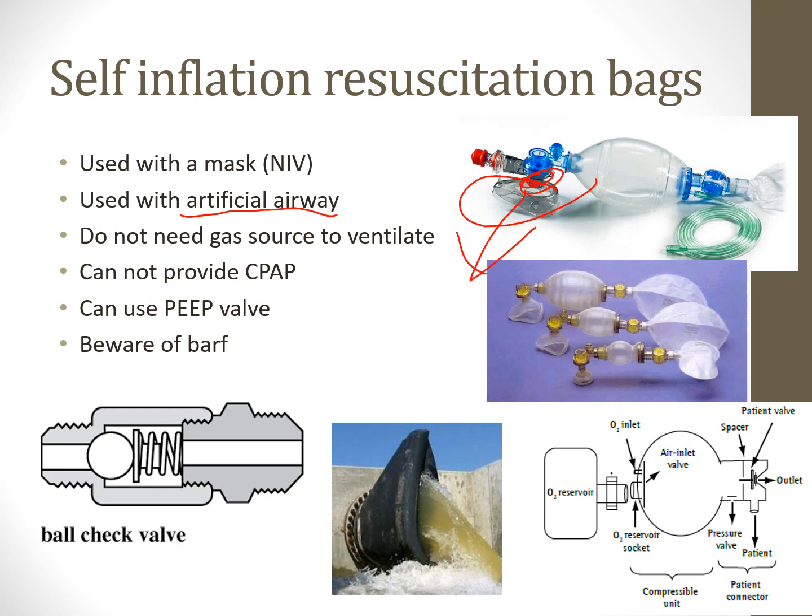You do not need a gas source to use a self-inflating resuscitation bag. Once again, you do not need a gas source to use one of these. So if there's no oxygen in the room for some reason, or if you have to do this outside the hospital, or you have to evacuate, you could still bag the patient. It would just be on room air. So you don't need a gas source.